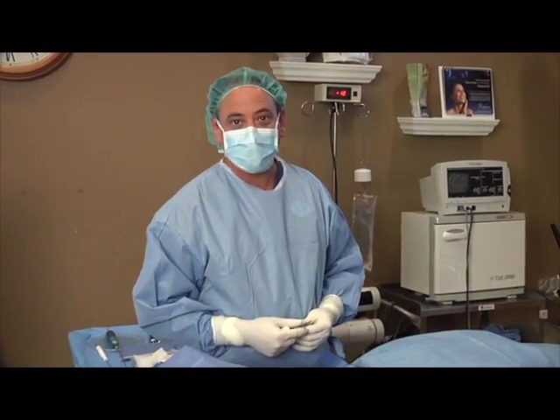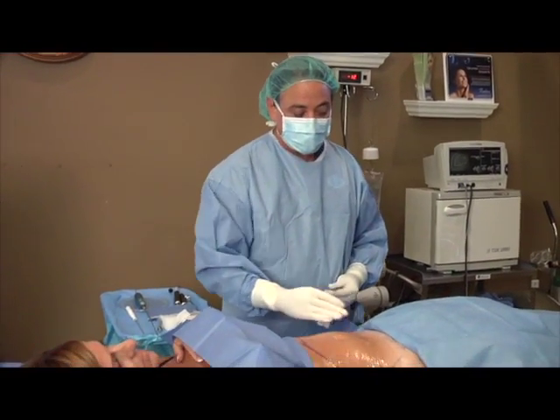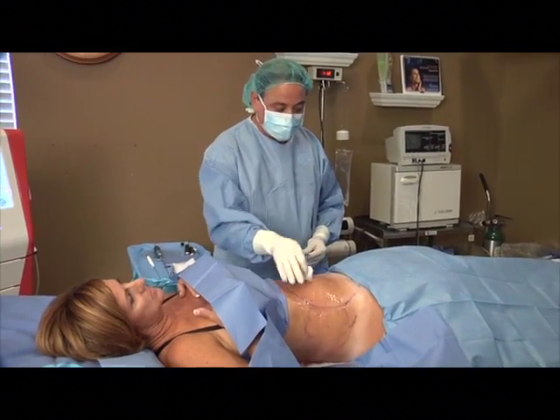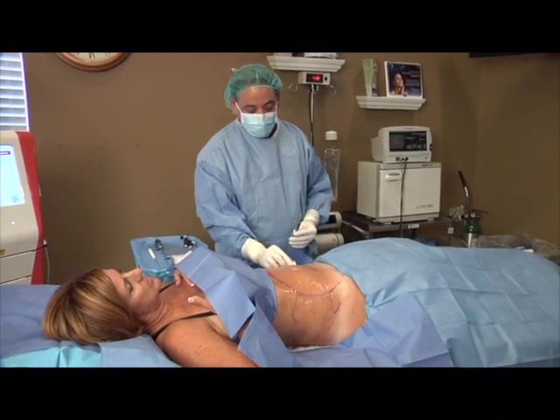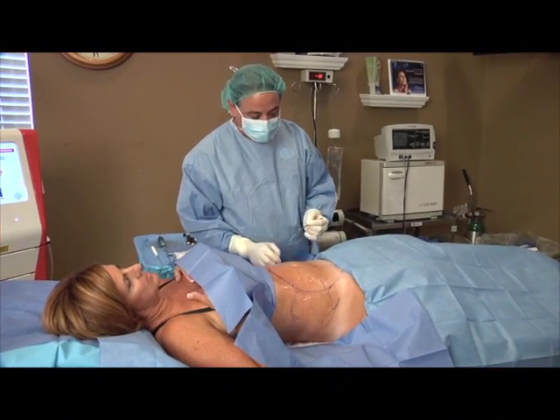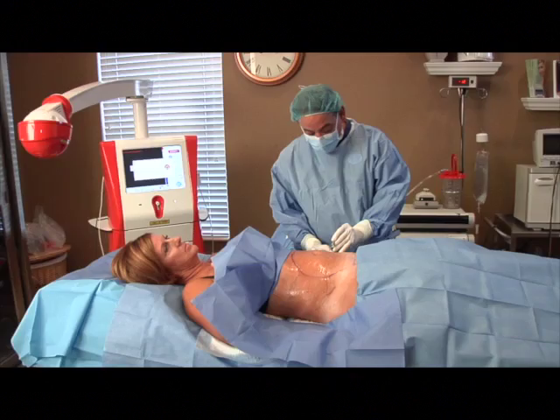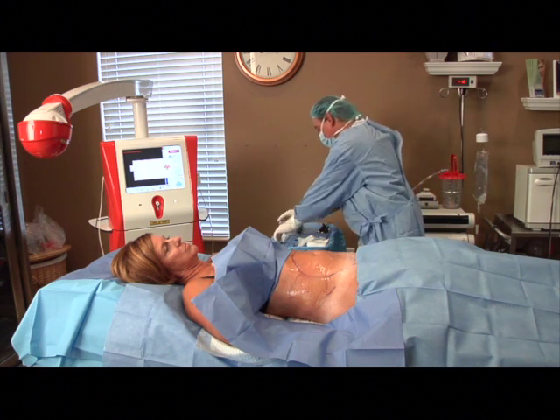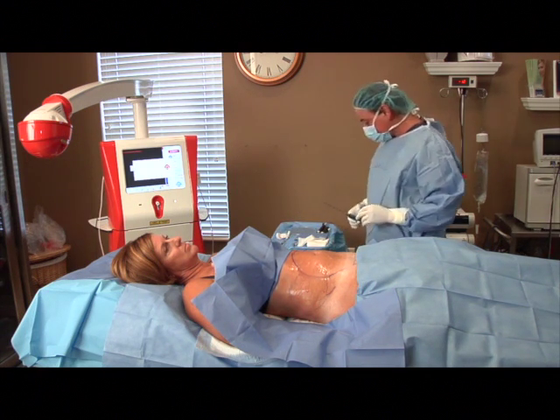In the operating room here with Betsy, and we're getting ready to do lipo control, the GPS lipo on her abdomen. So we've marked her, and she has had a few pills to relax, and we're going to make a little poke right here and start putting the numbing fluid in.